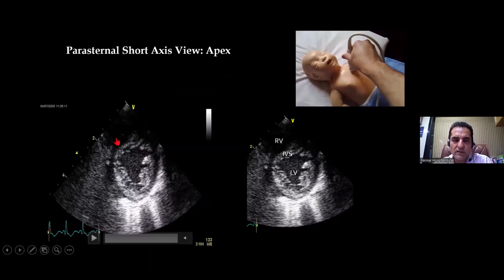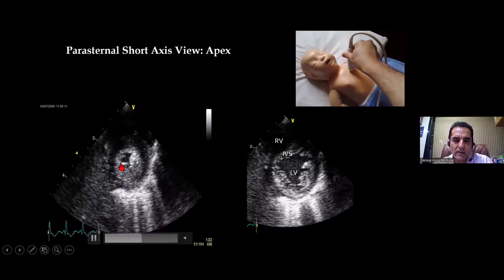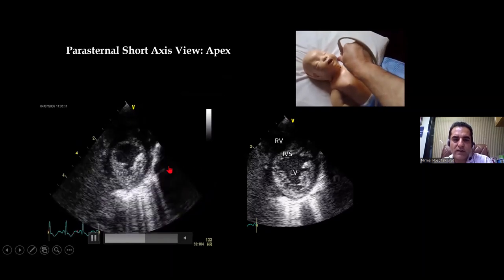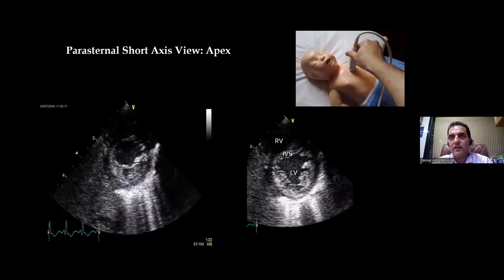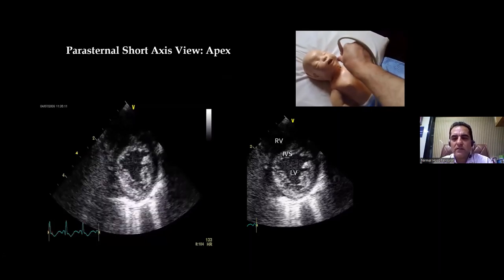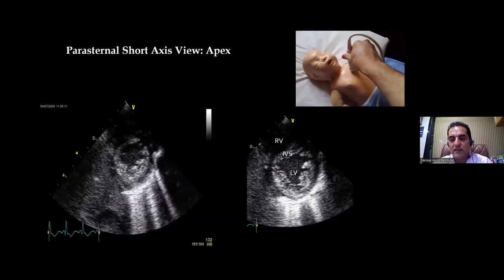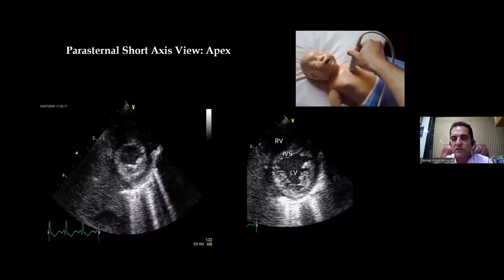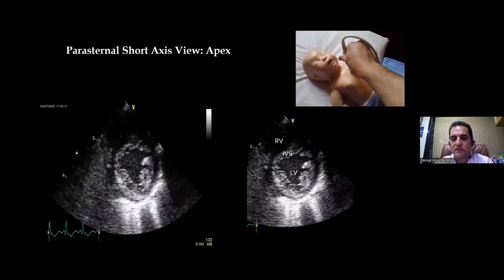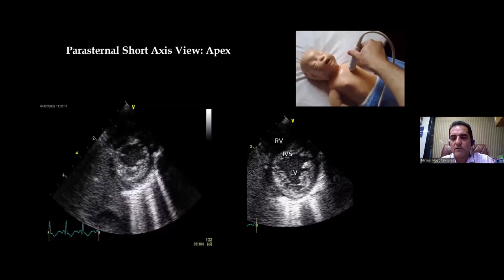Moving more towards the apex, the RV disappears and the apex is formed by the LV. This is normal — if the LV is not forming the apex, it means there is a hypoplastic left heart syndrome, or the RV is so much dilated that it has wrapped around the LV. In these two conditions, the LV will not be the apex-forming chamber, but in all other conditions the apex-forming chamber will be the LV.